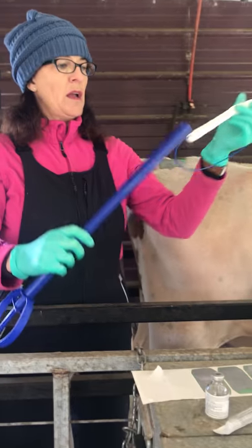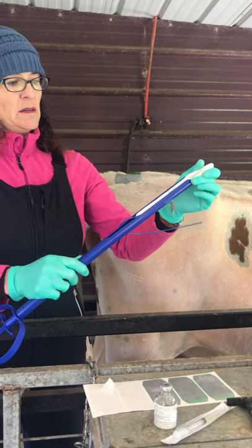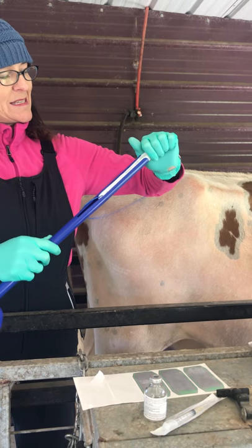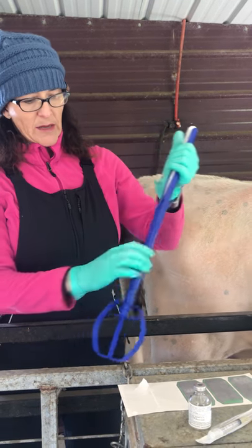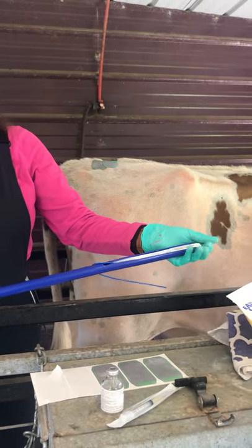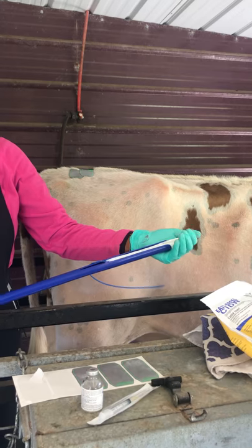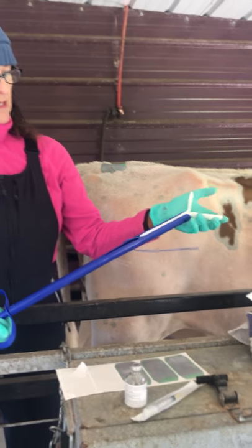So here's my gun. I'm going to load it like this — tail up — and then I'm going to press this end in here. Now it's loaded, and when I push this once I get it inside the cow, it's going to spread the wings out and it's going to stick.